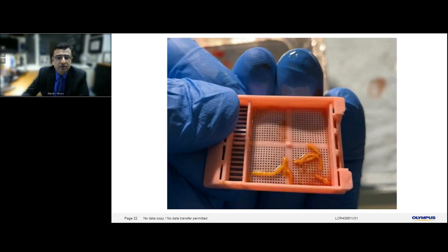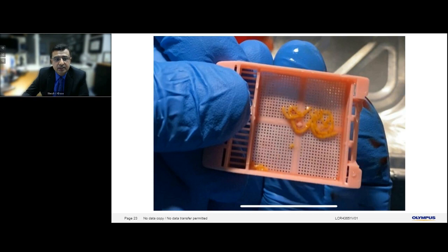And this is an example of a 19-gauge FNA, 3-pass EUS-LB specimen. As you can see, there are plenty of cores, more than enough for specimen assessment, both from the left and the right lobes of the liver. So these are cleaned off, and these pure liver cores are then transferred into a formalin container, then go for histopathology assessment.